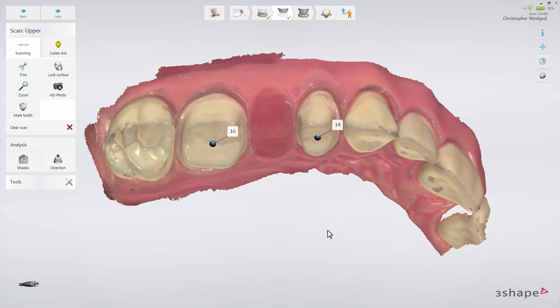Pressing the pop-up will rotate the scan to show the areas not scanned, indicated by amber arrows. If the holes are located at critical areas, such as the prep, margin line, or contact points, you will need to add some scanning here. Otherwise, no further scanning is required.